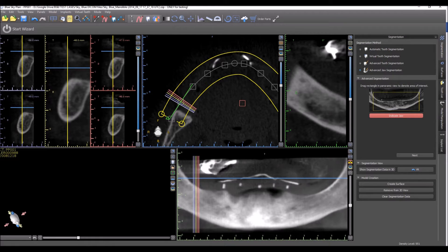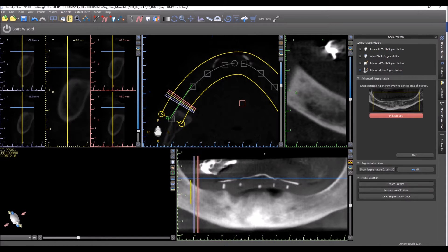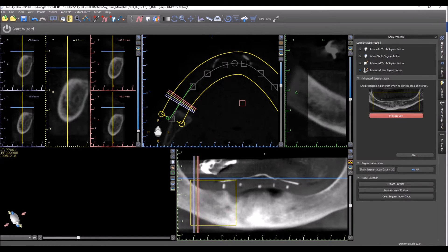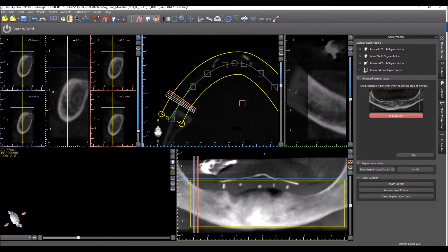We start off by indicating the jaw in the panoramic, holding down the shift key on the keyboard and left-dragging to draw a window around the relevant bone. We then go ahead and press next.